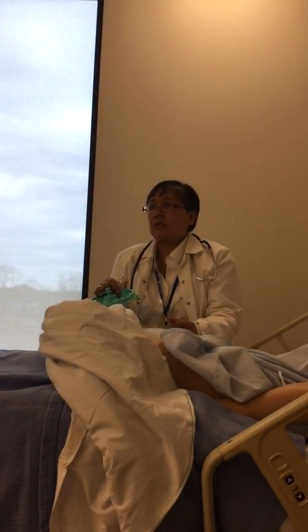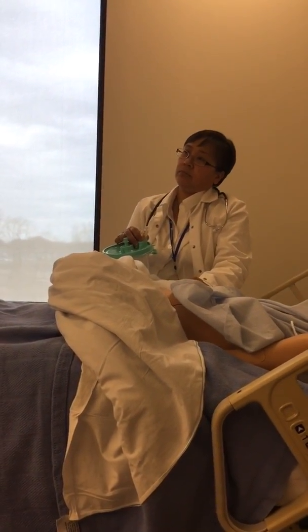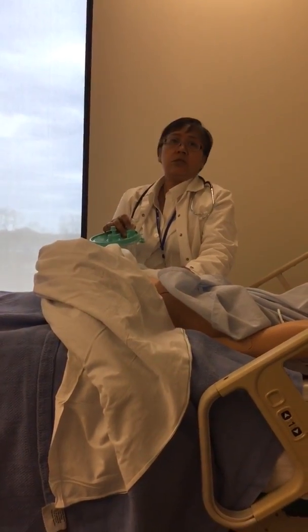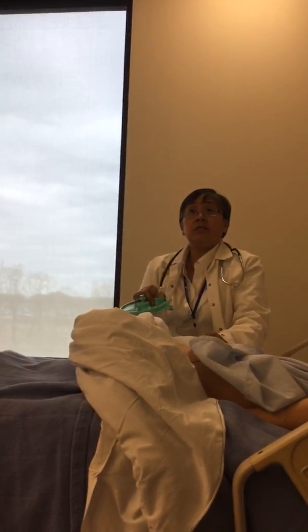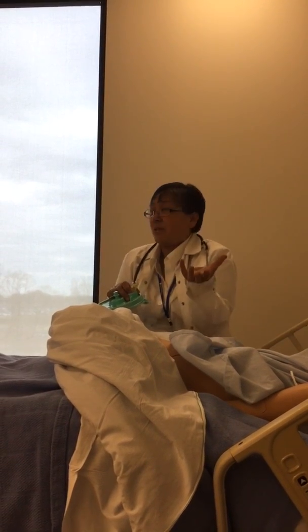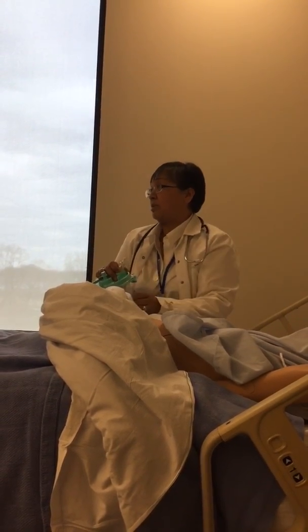What do I mean by a residual? Residual. There's too much stuff left inside. If you give 50 cc's in the stomach, hopefully it's gone through. It's not sitting in the stomach. If there's too much in the stomach, that says this patient's not digesting it properly.